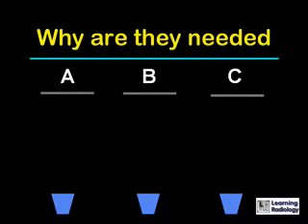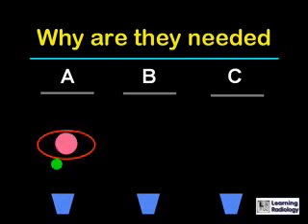If we look at three hypothetical patients, the horizontal gray lines here represent the X-ray cassettes, and the blue structures are the X-ray tubes. We're looking down on the patient's head. Patient A has a lesion on the anterior chest wall, and it projects there on their film.